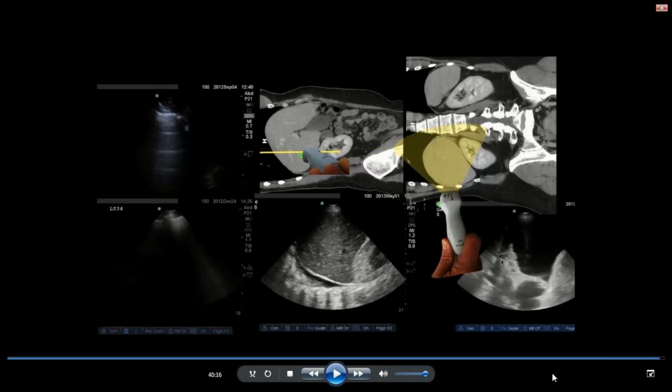And the question is, can you differentiate benign versus malignant effusion? It does turn out that there are some findings that will help you differentiate. For instance, freely floating echogenic particles that swirl in the pleural effusion are thought to be associated with malignancies, and sometimes finding actual masses within the pleural effusions themselves. But in terms of a clinically realistic approach, I'll ask Dr. Bhagra to chime in and give us the true perspective on this.